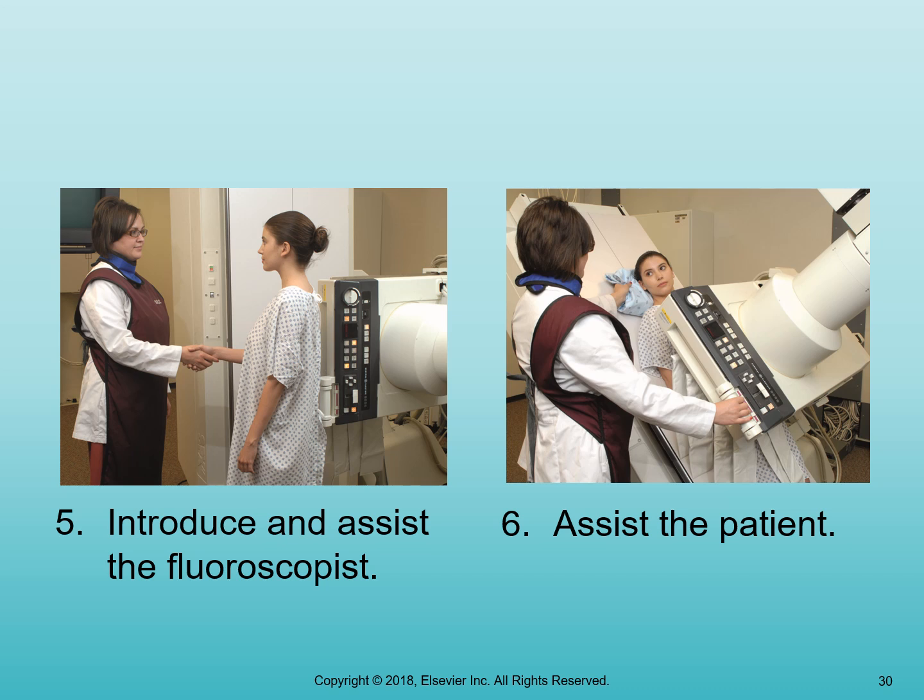So your scout image is literally almost like a covering of the patient or a covering of the radiologist, like an insurance policy to show what the patient looked like before they were given barium.